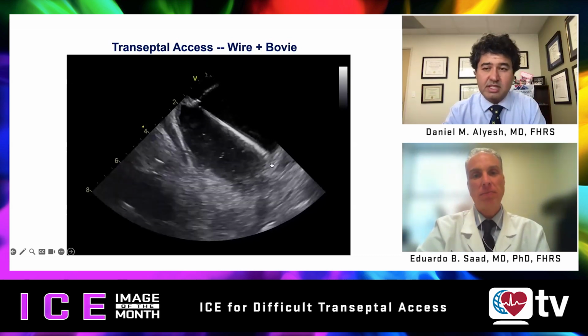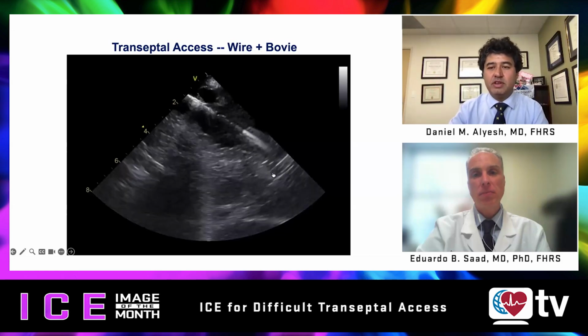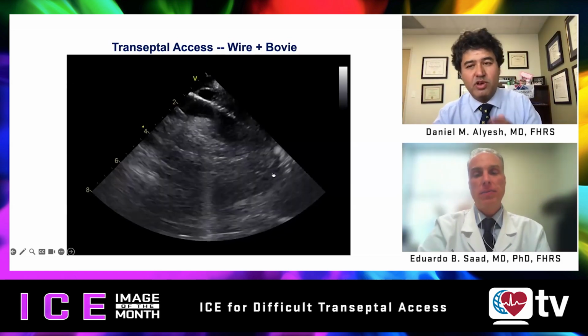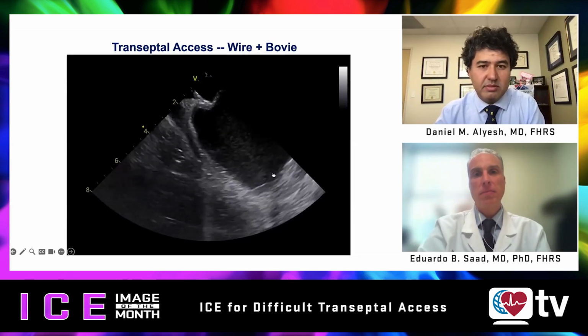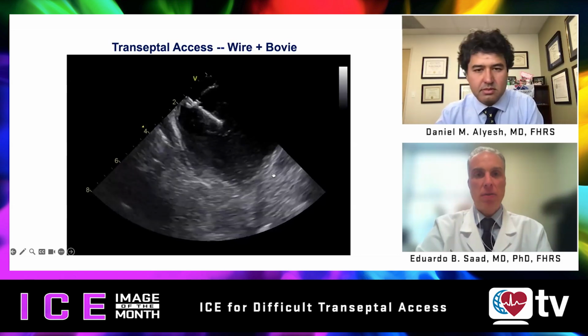Yeah, the jump with the step up, really, if you don't have something railed into something safe, that's when you can have a perforation issue, and perforation in the left atrium, as you know, can be a very, very difficult situation. So. Absolutely.